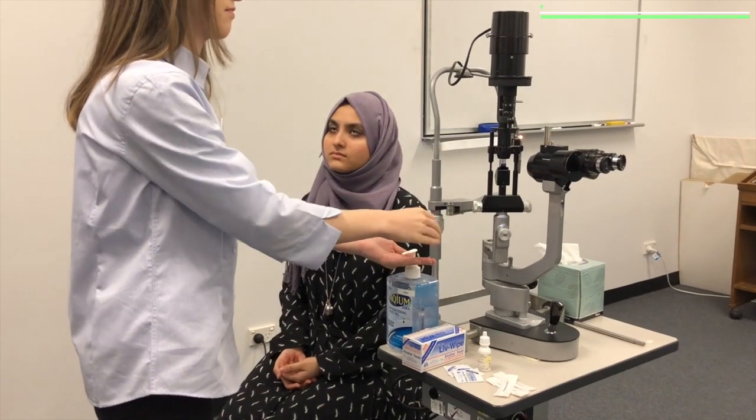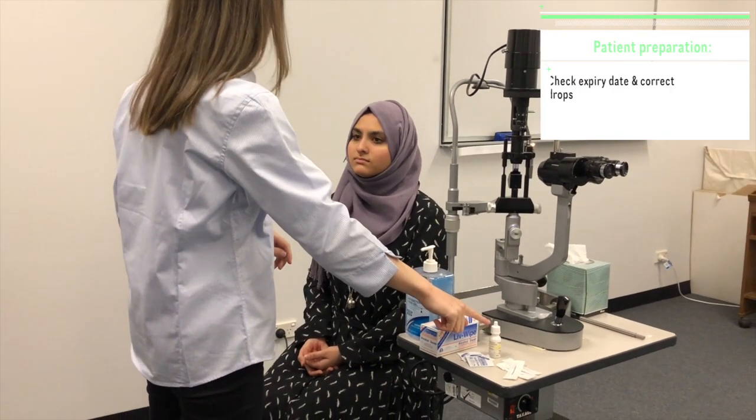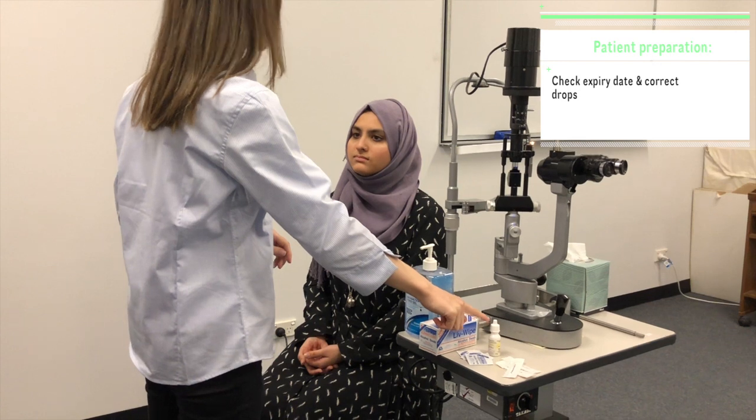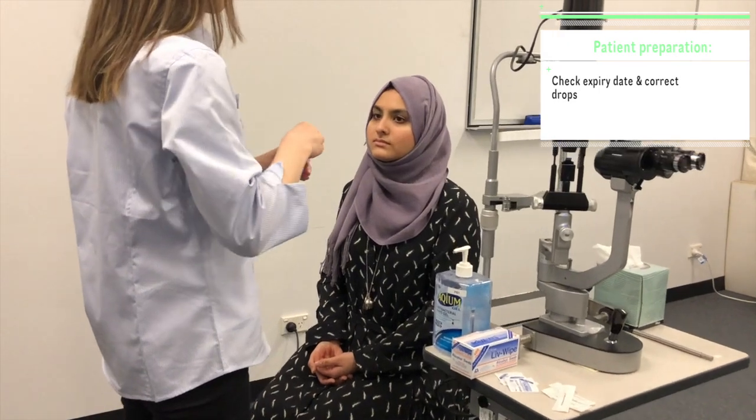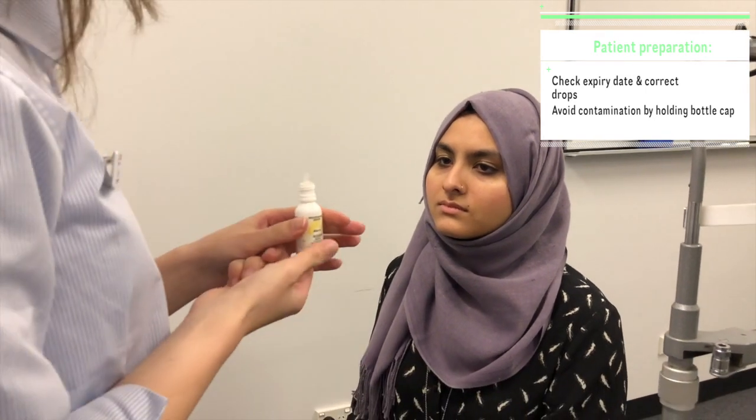Before the anaesthetic is administered, the examiner explains to the patient what they are performing. The examiner should first ensure that they are using the correct eye drops and that the eye drops have not exceeded their expiry date prior to their use. The examiner will maintain hygiene by removing the cap of the eye drops and holding it to avoid contamination.